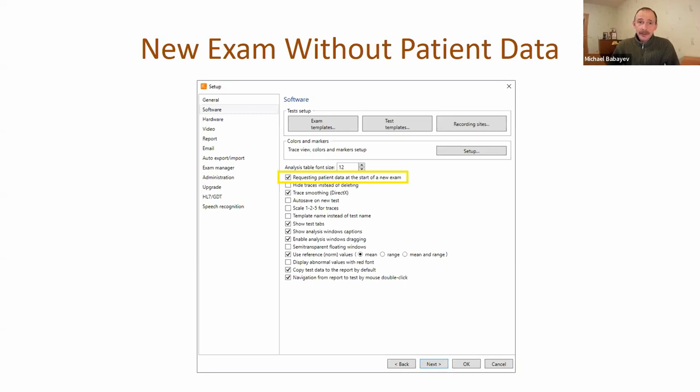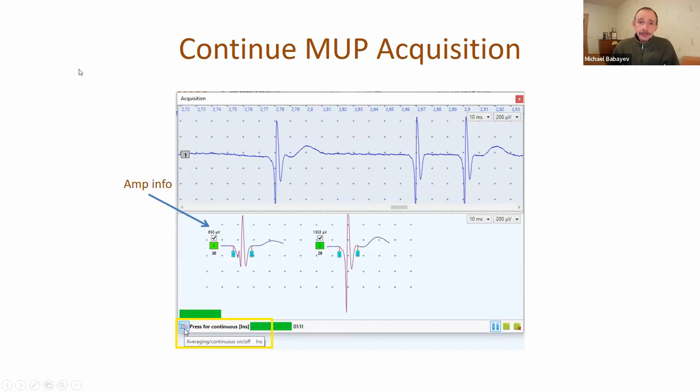Before superposing, we save the positions of all traces. Now it's also possible to start a new examination without patient data input. If you check this checkbox and start a new examination, you will go directly to the tests without entering new patient information. This is necessary sometimes for screening purposes.